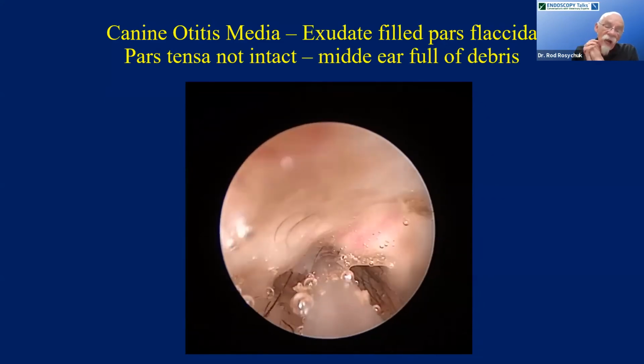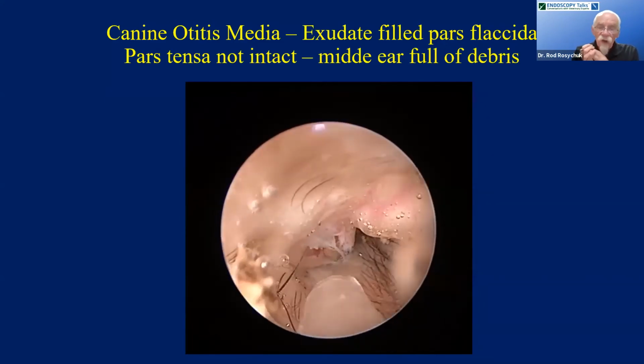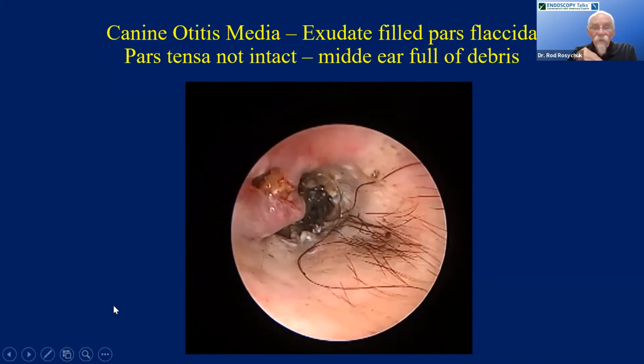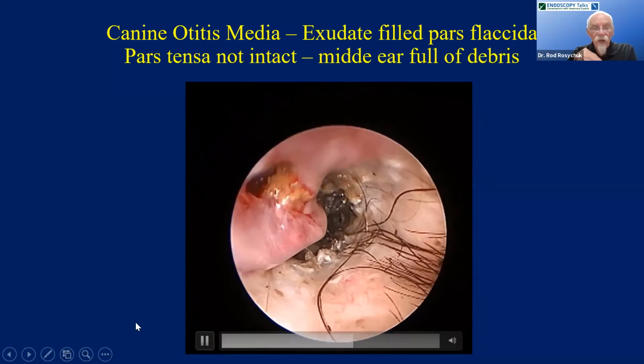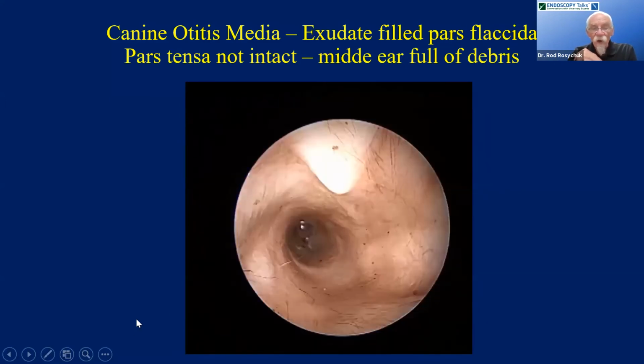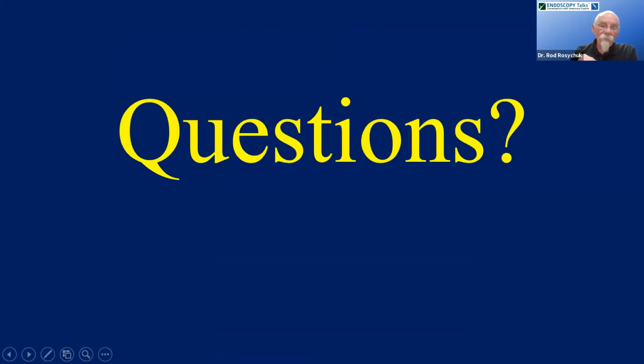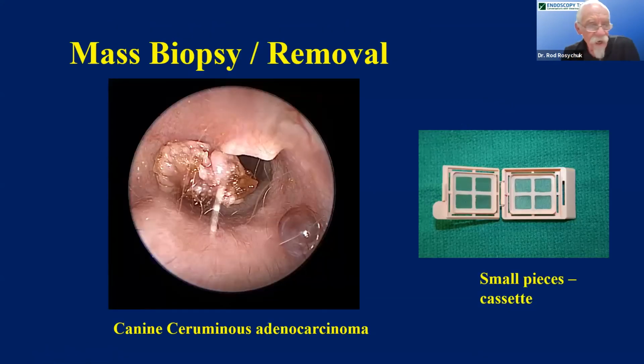Oftentimes, the tympanum may or may not be intact behind this dilated pars flaccida. This one, it wasn't. And then we had material extending into the middle ear, and we ended up having to go into that ear to clean that material. I'm just going to pass beyond that since we've got a little more limited time.